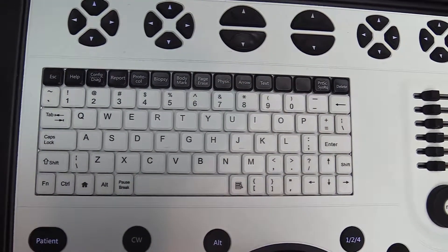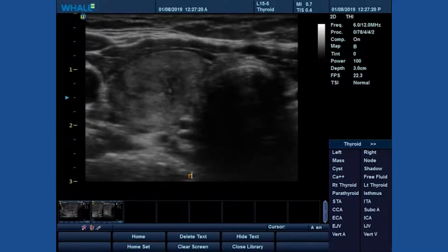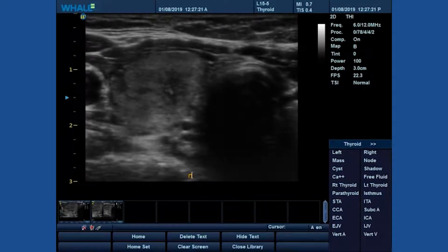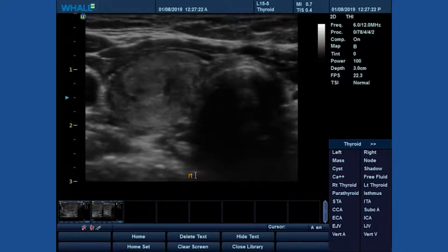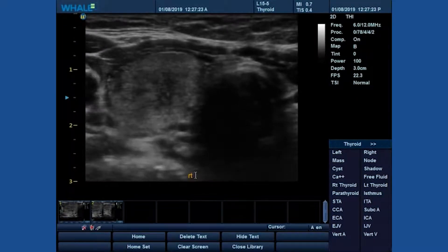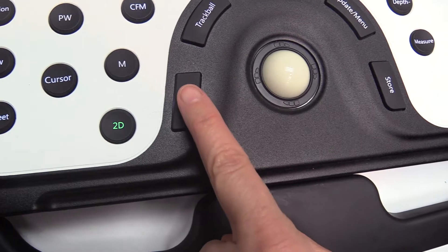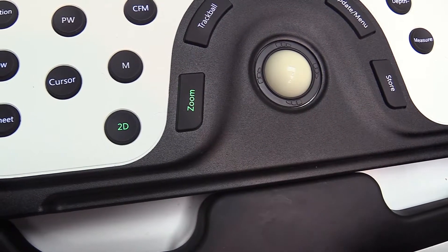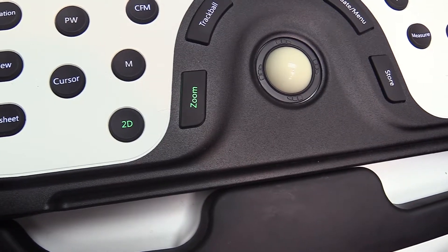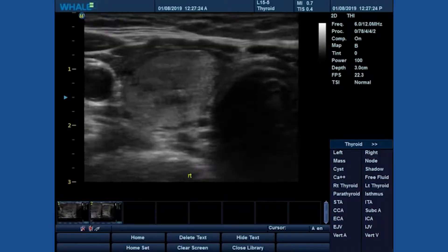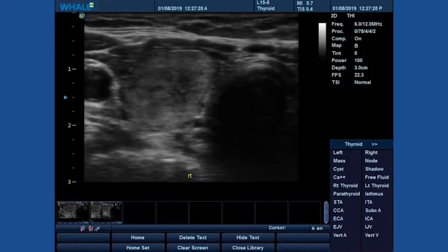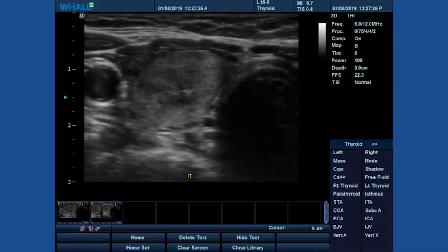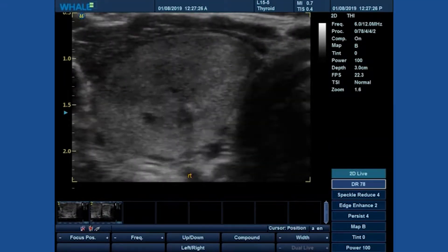Text on the image will remain even as zoom is being used. To exit, you may hit zoom or 2D to go back to scanning mode.